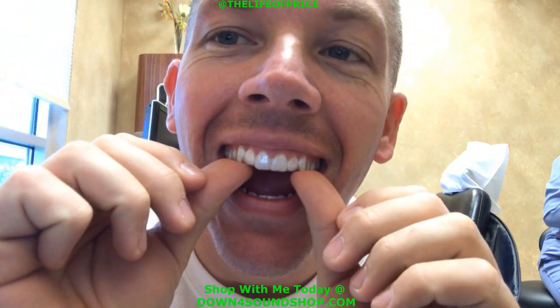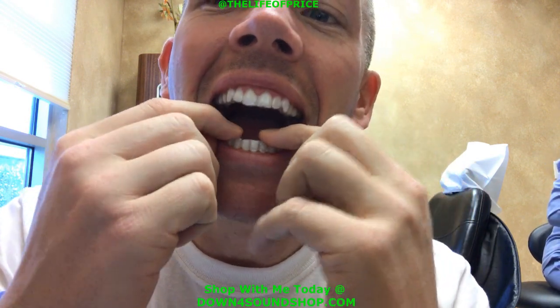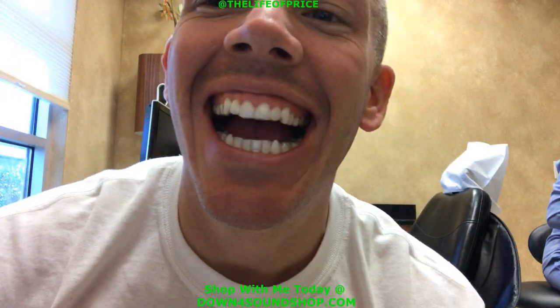You can do the top. Top usually is a little easier. Is that right? Yeah. That wasn't so bad putting it on. I don't know about the whole taking it off thing. Alright, so now the bottom. Alright, so that's it. I can definitely feel some snugness.